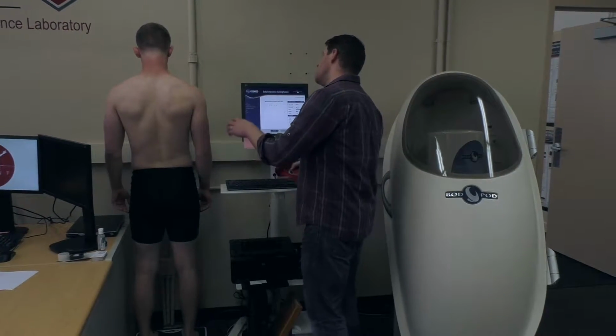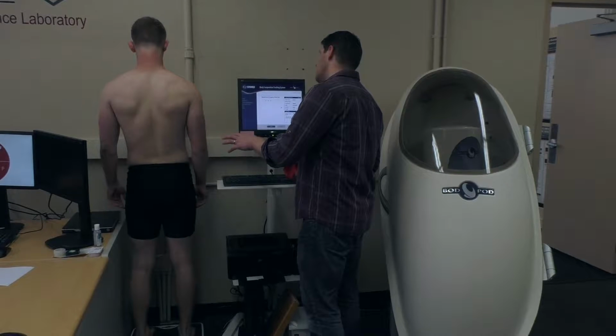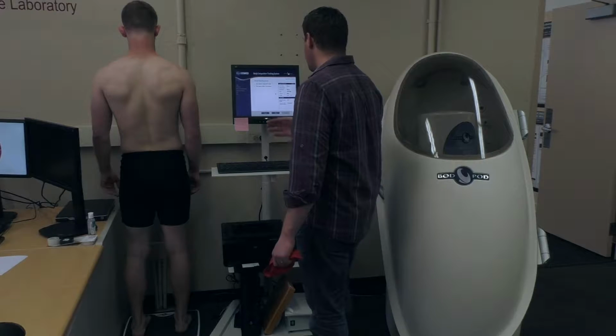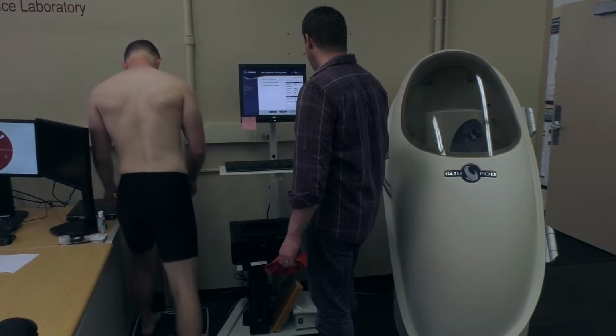Now, Mr. Participant, when you are done, when I ask you to step back, don't turn around, just take one step back and off, okay? Okay, now you can take a step off the scale.